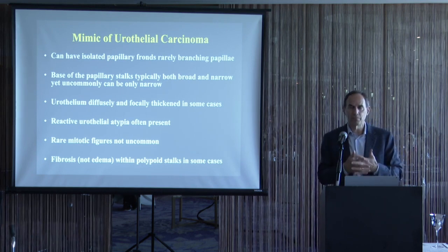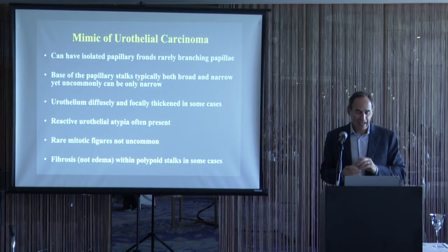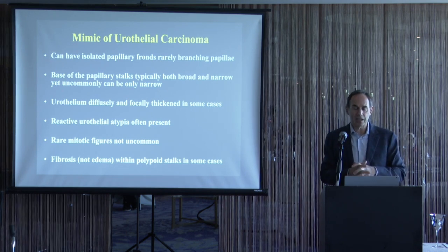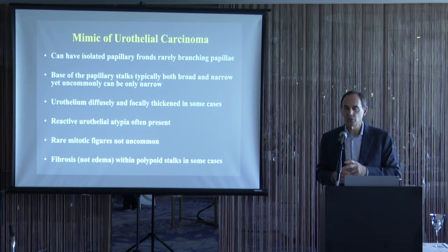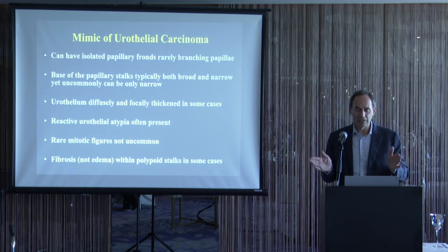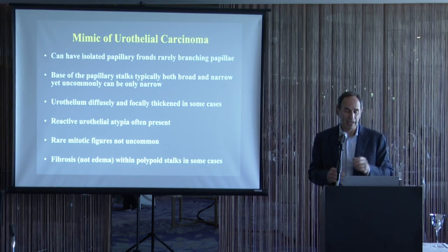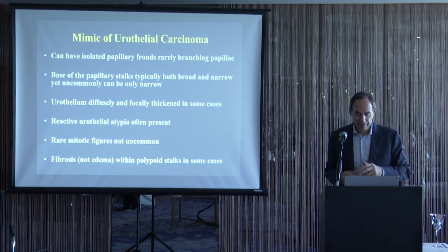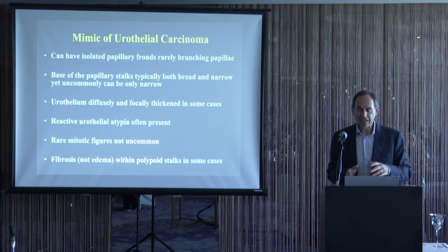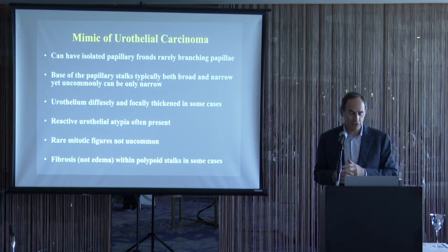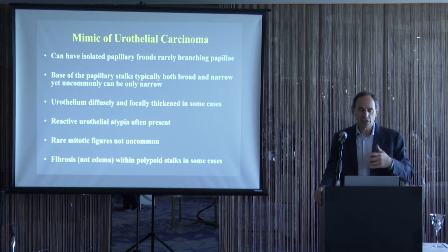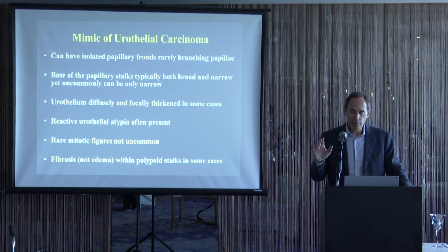Polypoid cystitis mimics urothelial cancer because it can have isolated papillary fronds that look neoplastic, occasionally branching fronds, and sometimes thin-based structures. Thickened urothelium is often associated with neoplasms but can occur in polypoid cystitis. Reactive urothelial changes and mitotic figures may be present, since this is a reaction to injury. Classic broad-based, edematous bullous cystitis with scattered inflammatory cells is not diagnostically problematic.